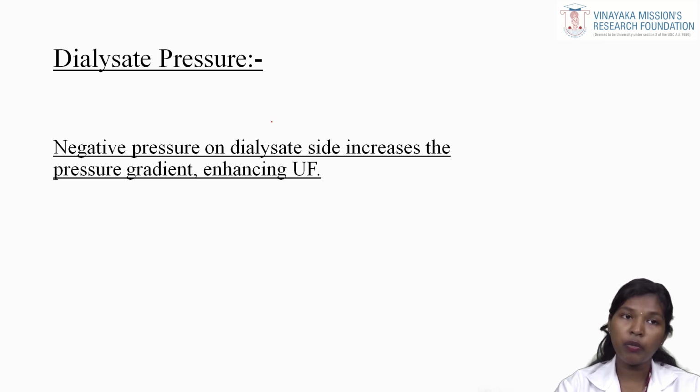Due to that, TMP pressure will increase. So we can find that something inside is faulty, so we can adjust the pressure, and we can treat further. We can change the dialyzer or we can go for further treatment.